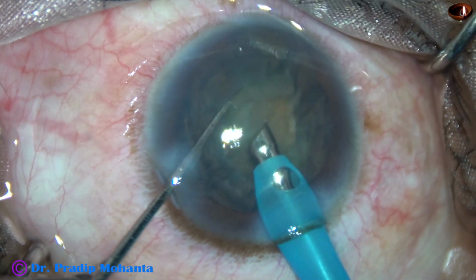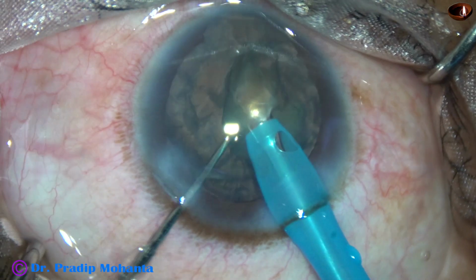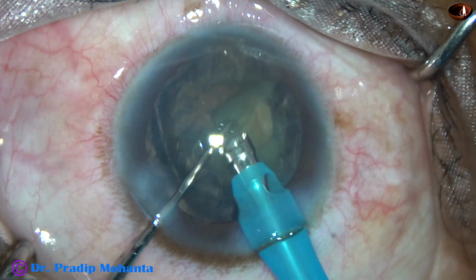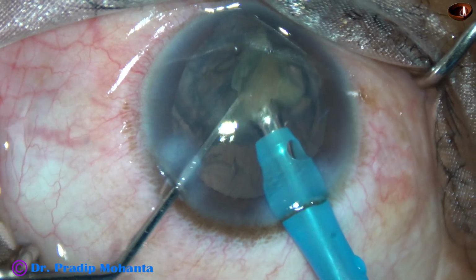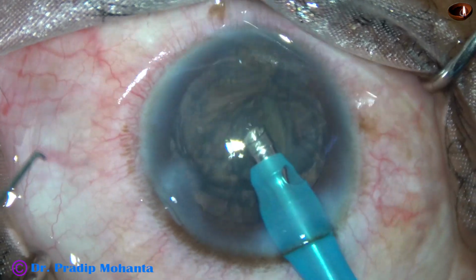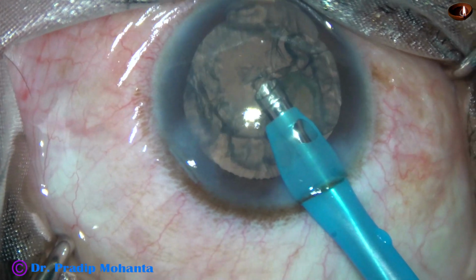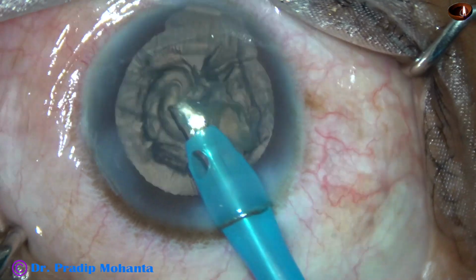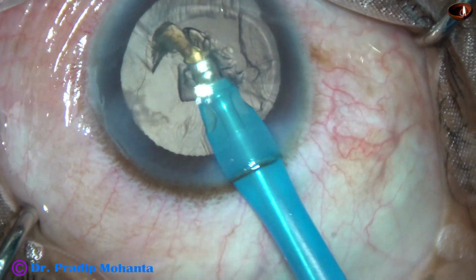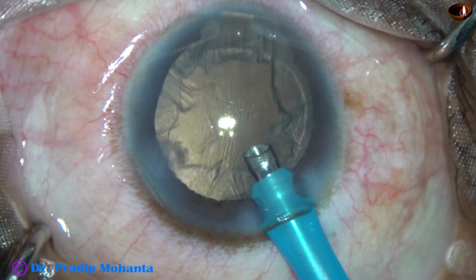This is the last piece. At this time I have decreased the vacuum further to about 250 and emulsifying this last nuclear piece, and I keep a sheet of epinucleus as a cushion between the posterior capsule and the nuclear piece. And now I decrease the vacuum further for this epinucleus. I keep the vacuum at 150, flow rate 25, and manage this epinucleus. And it was managed okay.